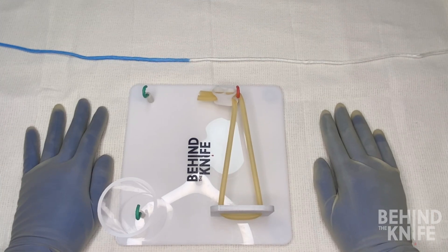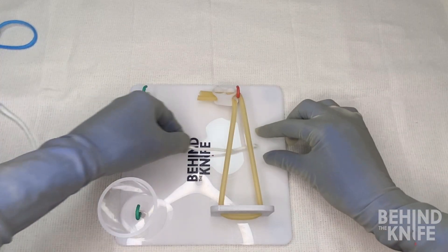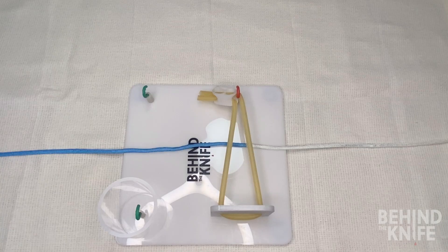To start, we'll put our knot tying board in front of us and thread our practice string behind the side that has the Penrose drain. I'm going to put my blue side of my string on the left side and the white side of my string on my right side.